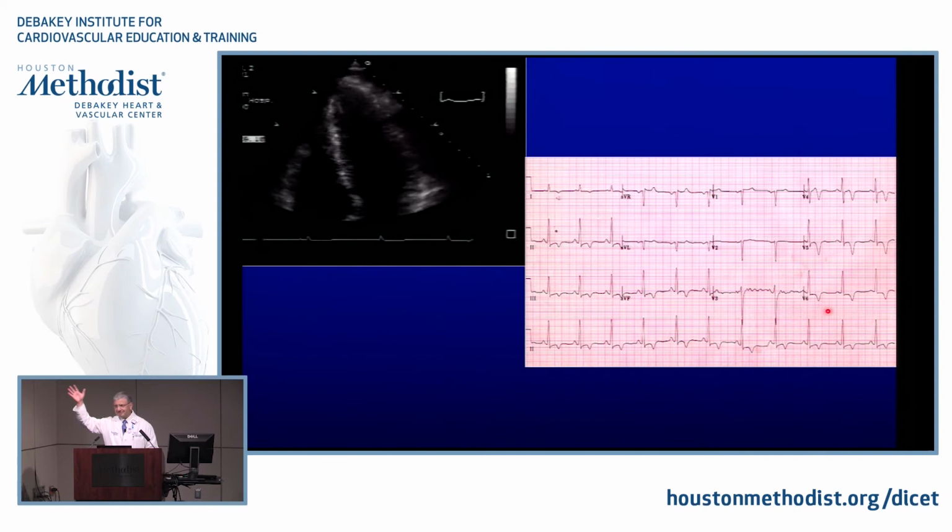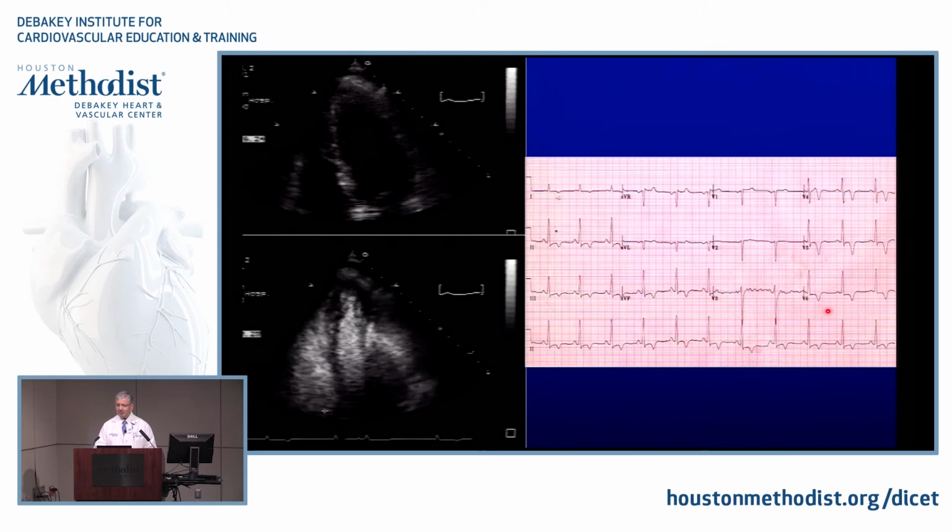What do you guys think? So you just like have a live audience here. What do you see? Apical infarct? There's hypokinesis of the apex, and it goes along with the EKG, but the EKG may be more impressive than what it is. I just don't know, right? Message here is, if you don't know, you'd better get something to help you. And indeed, look at that. That's an apical hypertrophy. Okay?